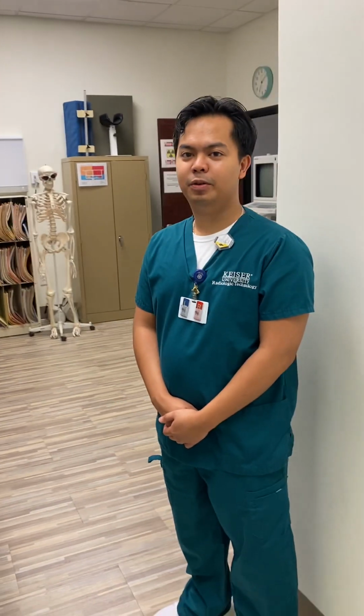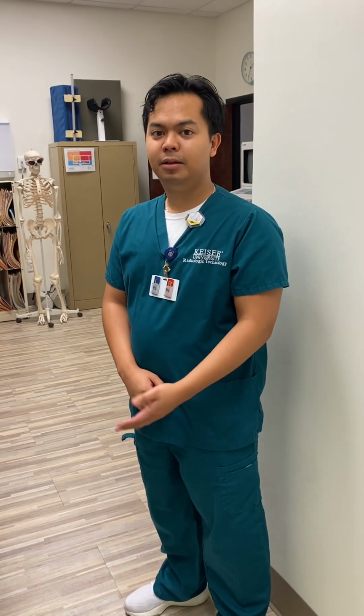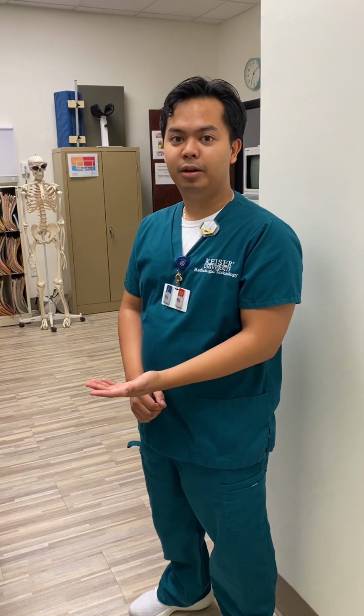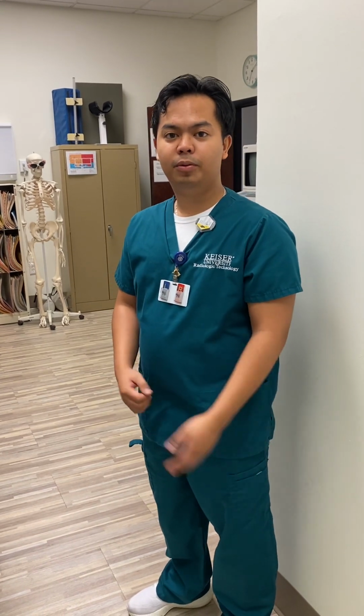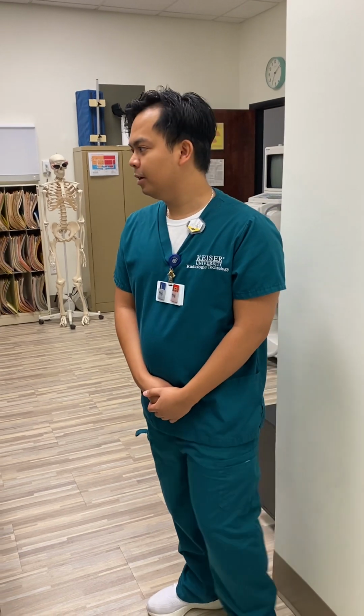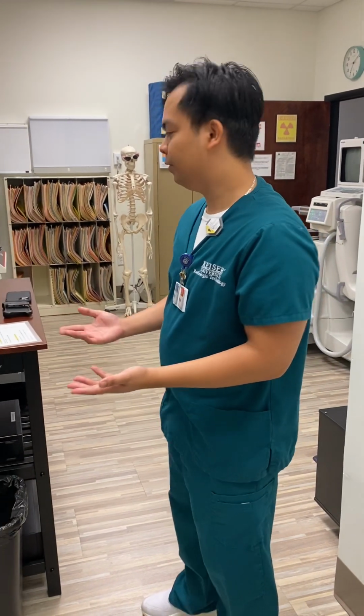Hello. We're doing the AP Lordotic supine today, because we're not doing the standing AP Lordotic. Our patient is going to be non-ambulatory, so they can't walk around or stand as well as ambulatory patients. So we're going to set up our stuff first.